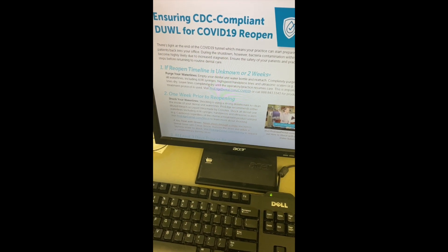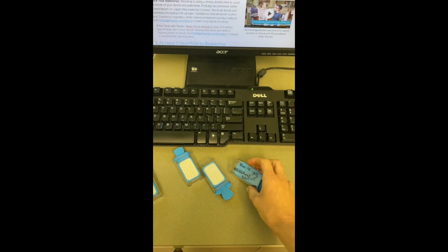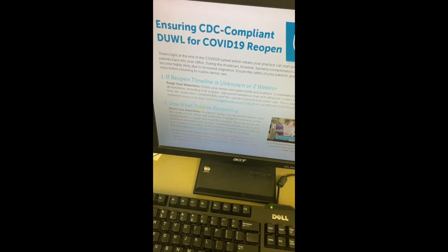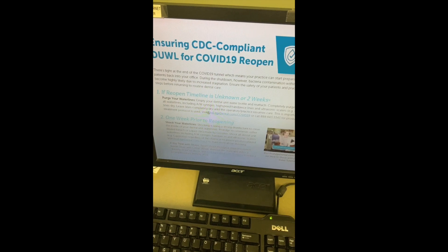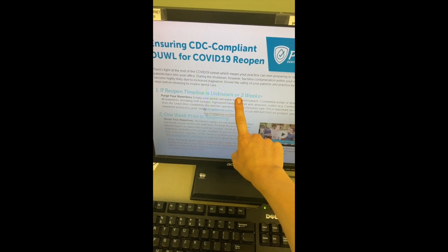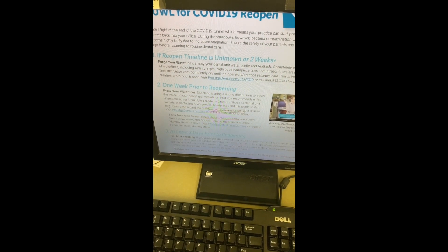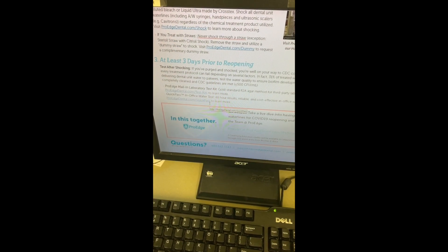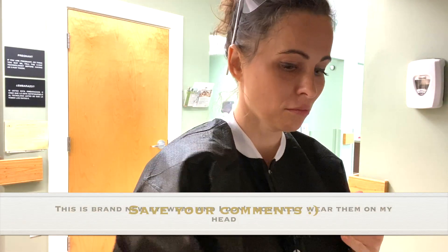Hey y'all, I'm in the clinic today doing my well - I'm shocking because I had some water tests that did not pass. I'm doing a shock and I was looking up the dilution for the bleach, and look at all the helpful information that Pro Edge has. I'm not going to be opening for two weeks, so my lines have been purged and I still will purge, then look - one week prior to opening, at least three days prior. Pro Edge is great, check them out!